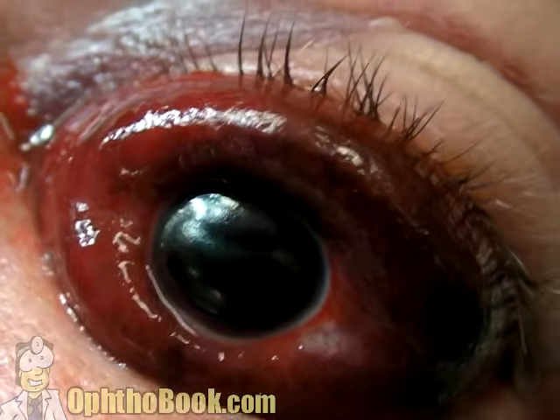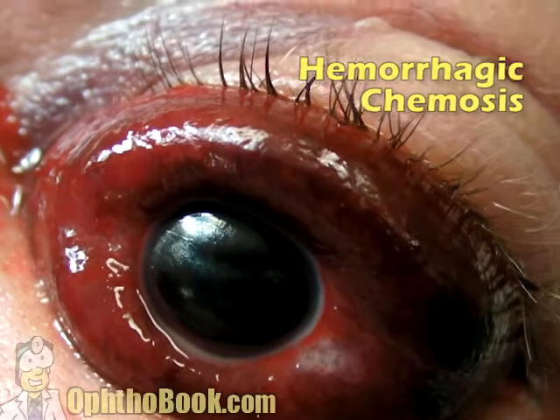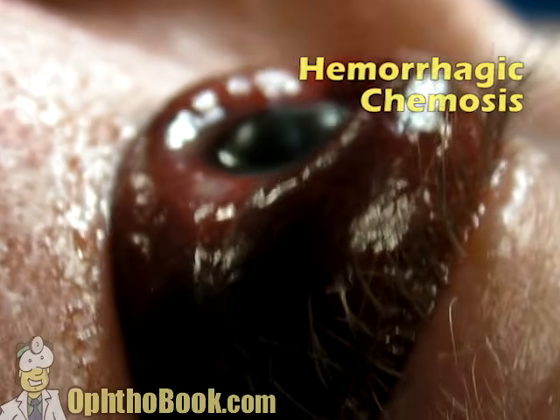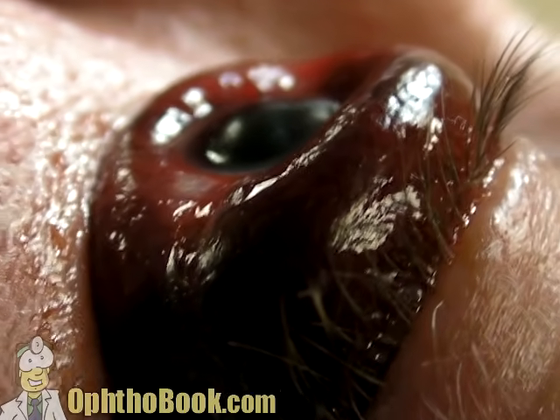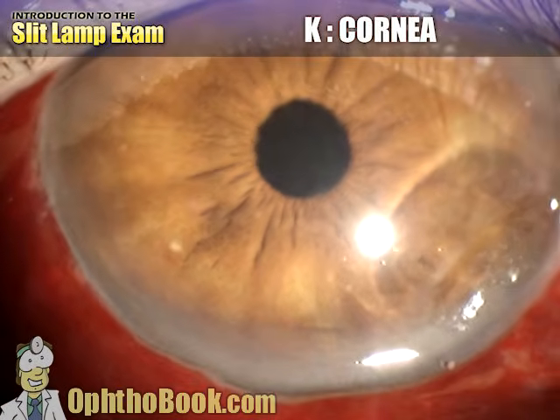You get a very puffy allergic response. It can look quite impressive, but this looks even more impressive. This is a hemorrhagic chemosis. This is actually blood under the conjunctiva that's bulging forward, and it's really quite impressive how far forward the conjunctiva skin can bulge. Moving on to our cornea.